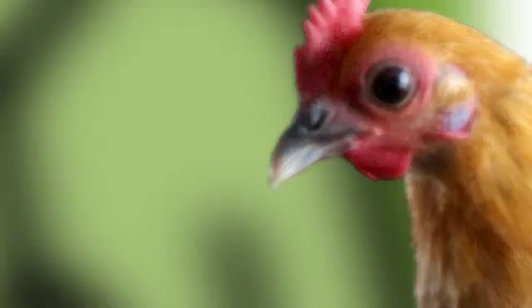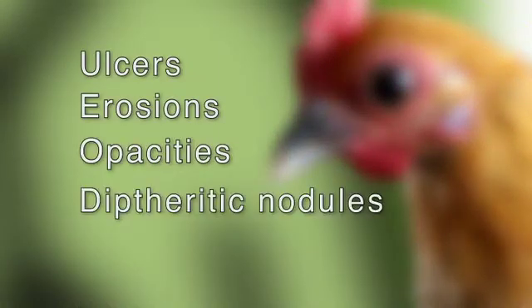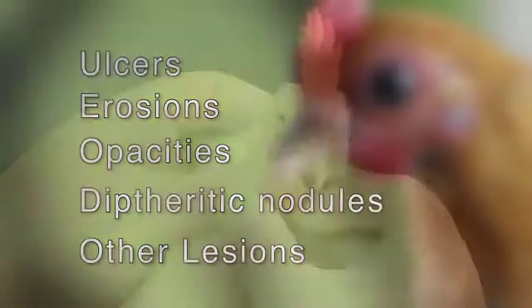Inspect the color and consistency of the oral mucosa. Keep in mind that lighter birds will have a pink mucosa, and darker birds will have more pigment. Look for ulcers, erosions, opacities, diphtheritic nodules, or other lesions.